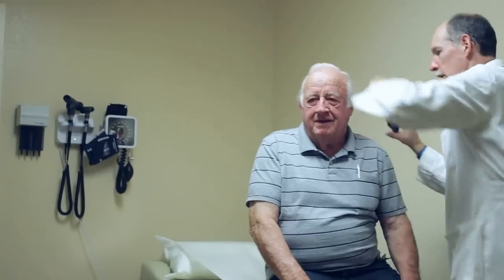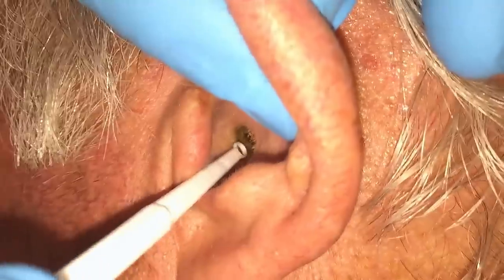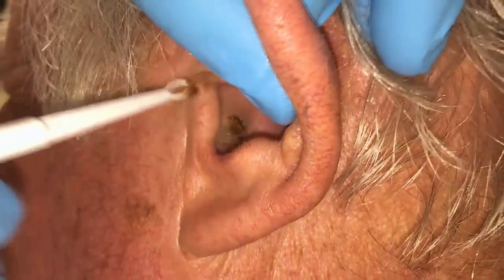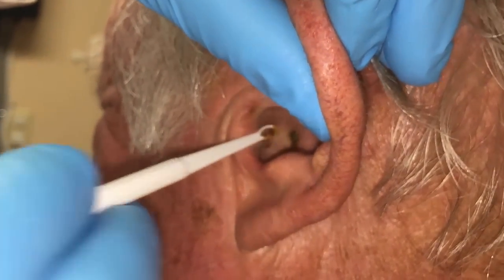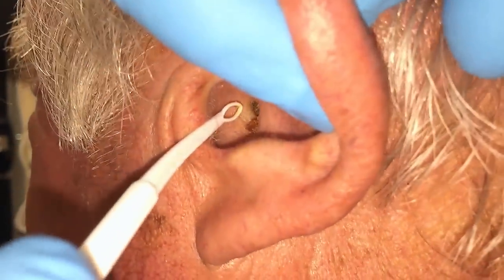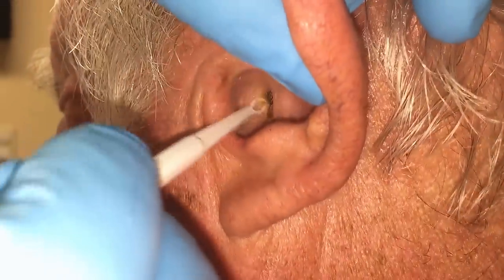This is your left ear. We're looking way in there and seeing it's just packed in. Do you stick Q-tips in your ear? The other day you did. Am I hurting you at all? A little bit. Even that hurts — and that's simply from putting my curette right in the external auditory meatus, the opening. That's very sensitive. Okay, we're not going to do any more with this — that's good, done with that.